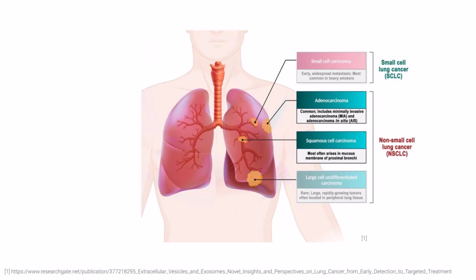According to the dataset's paper, adenocarcinomas are tumors that exhibit microscopic glandular-related tissue cytology, tissue architecture, and/or gland-related products. Squamous cell carcinomas are characterized by observable traits of squamous differentiation, such as intercellular bridges, keratinization, and the formation of squamous pearls.